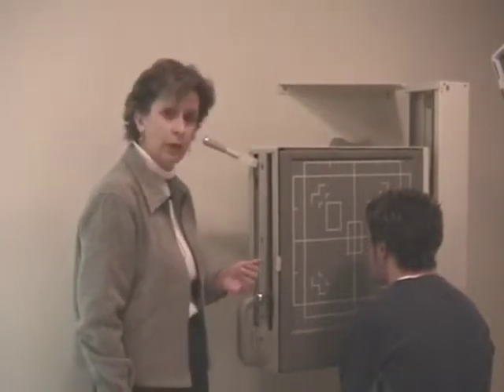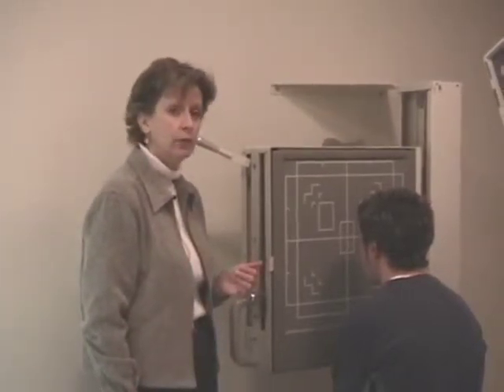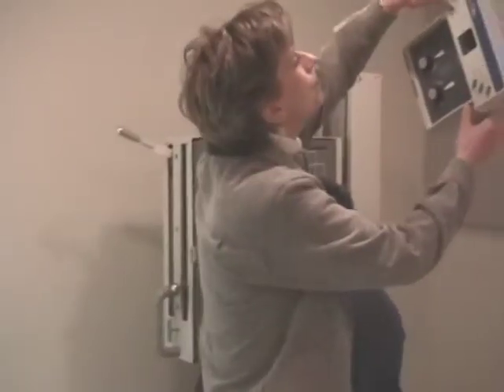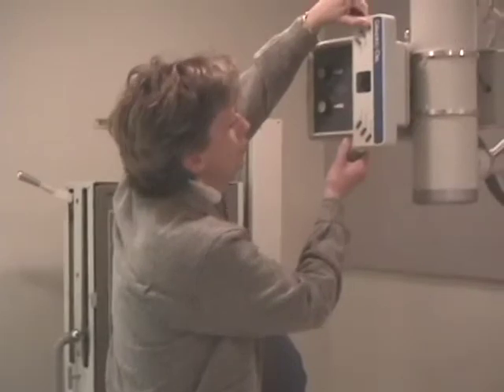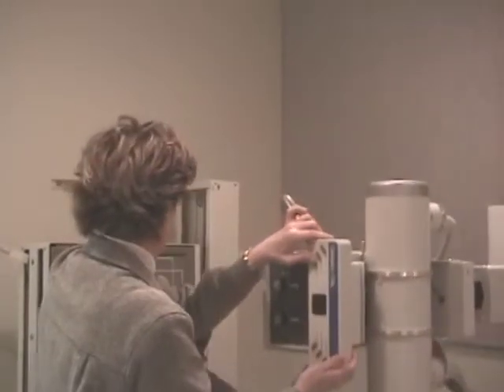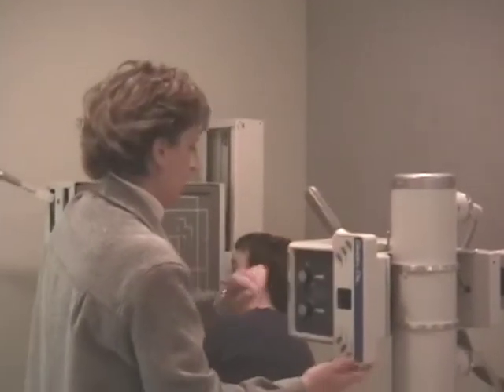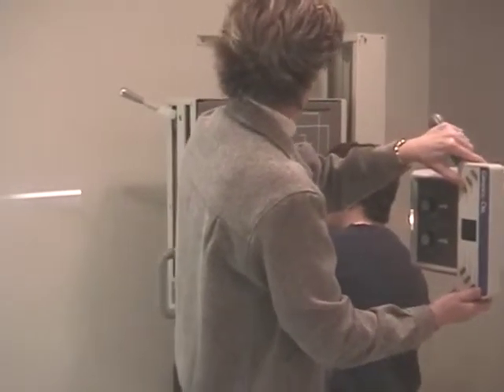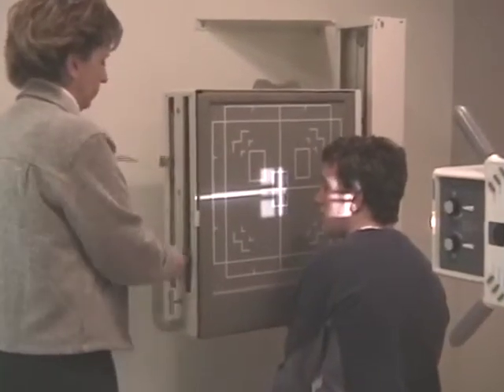I'm going to position my patient for the parietal acantho projection, also called the Waters. We will have a perpendicular beam. Collimation remains the same. Change your film.